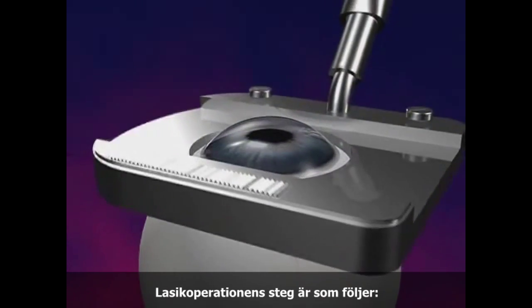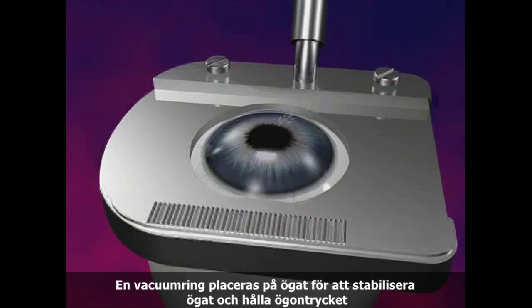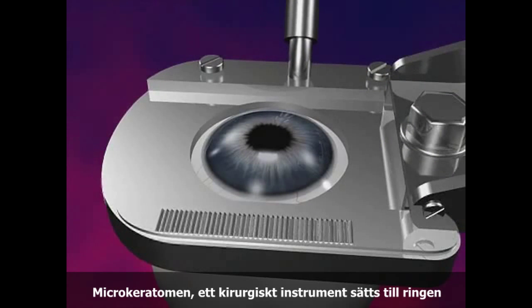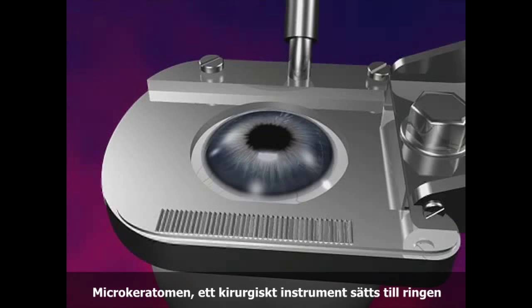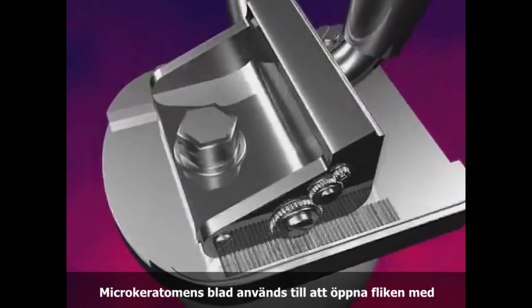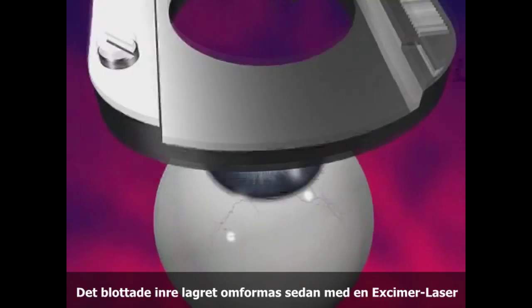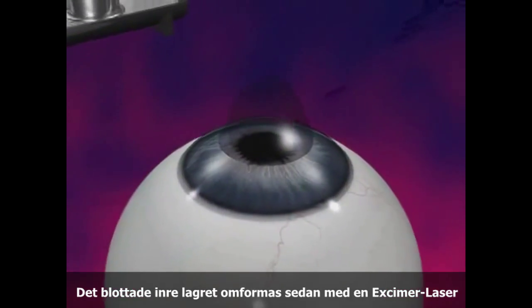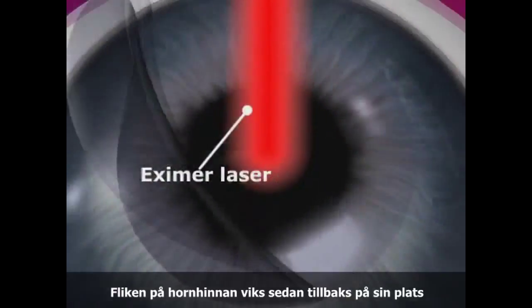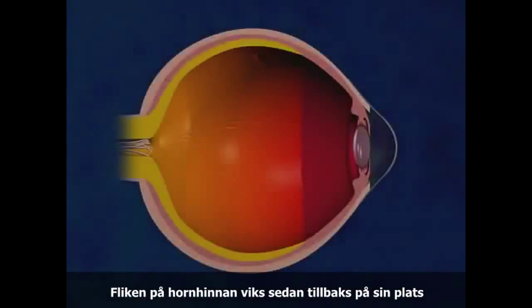The steps of the procedure are as follows. A suction ring is placed on the eye to stabilize and check the eye pressure. The microkeratome, a cutting instrument, is attached to the suction ring. The blade of the microkeratome is used to cut a flap in the cornea. The exposed inner layer of the cornea is then reshaped with an excimer laser. The corneal flap is returned to its original position.